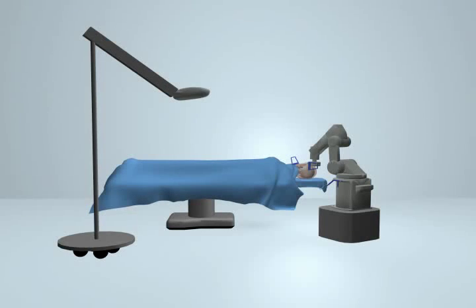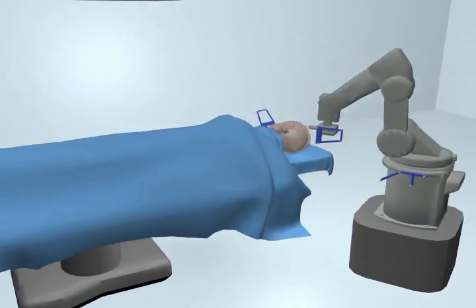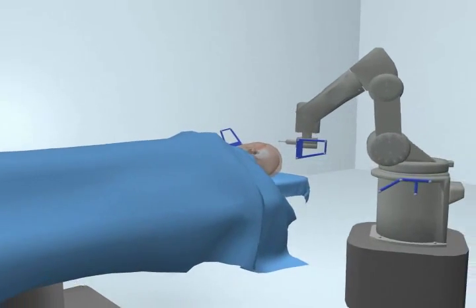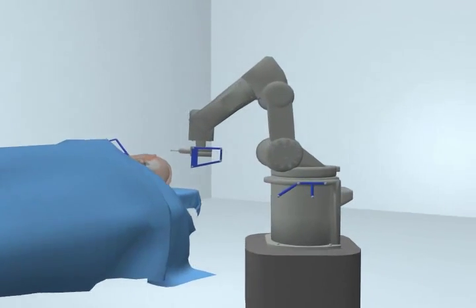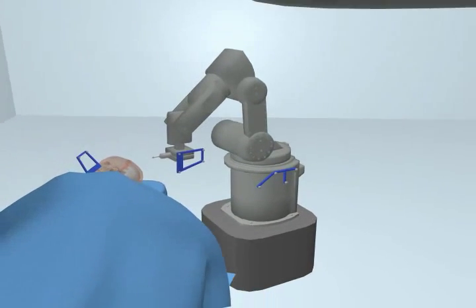In the operating room, the robot is positioned next to the patient. The tracking system overlooks the surgery. It tracks both the position of the robot and the position of the patient.